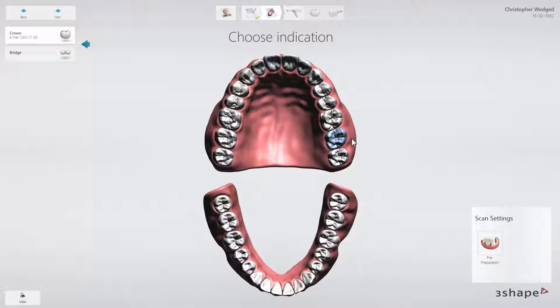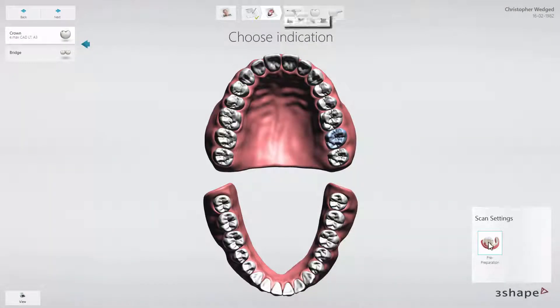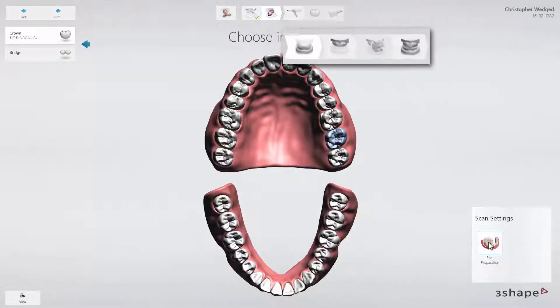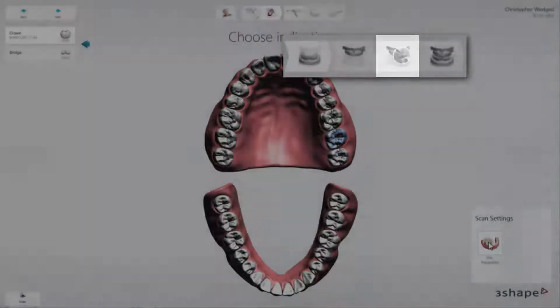As mentioned earlier, it is also possible to copy a tooth from a pre-preparation scan. This workflow involves taking a digital impression of the pre-preparation tooth. To do this, select the pre-preparation icon whilst on the case setup page. An extra pre-preparation scan step will be added to the workflow.